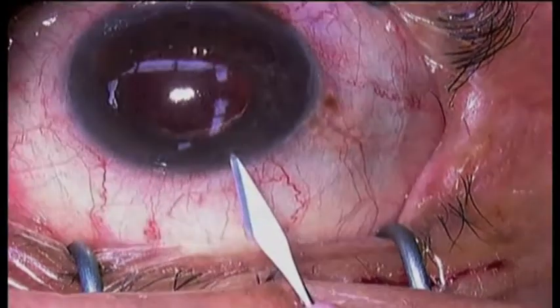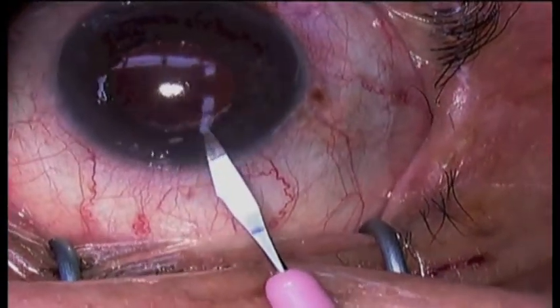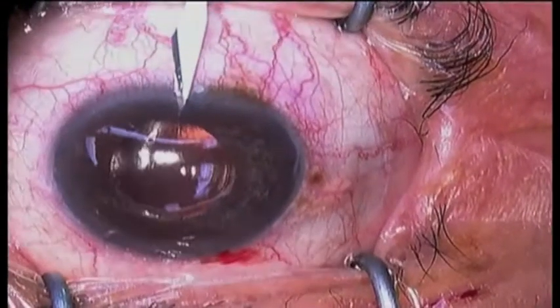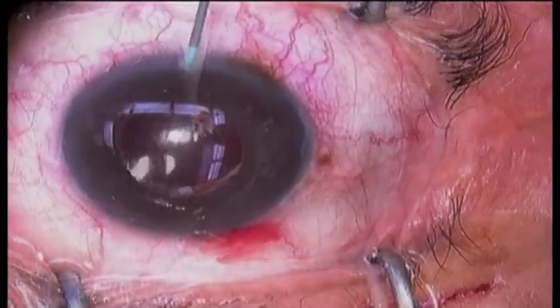This is a patient who is having an IOL exchange and trabecular aspiration for glaucoma. He has a multifocal intraocular lens in the ciliary sulcus.